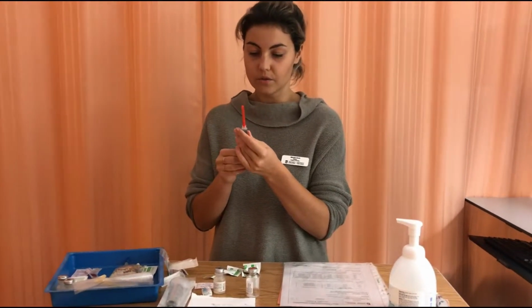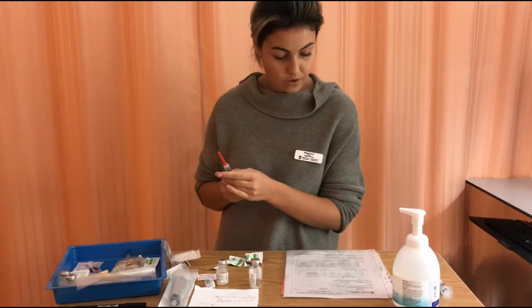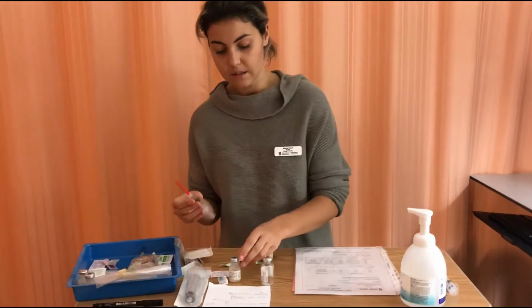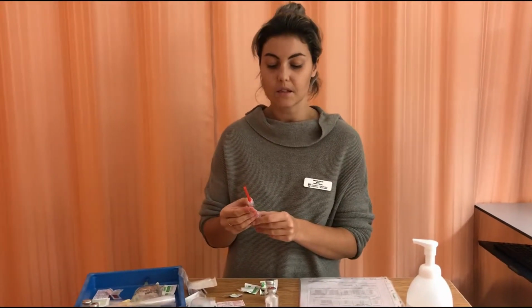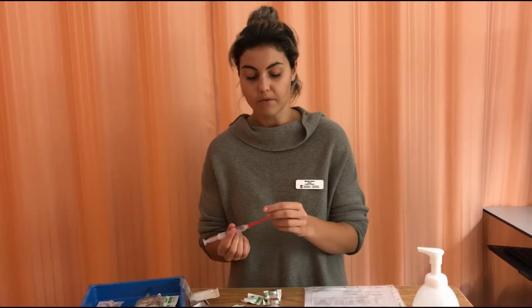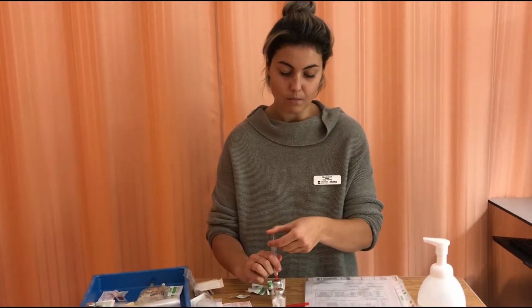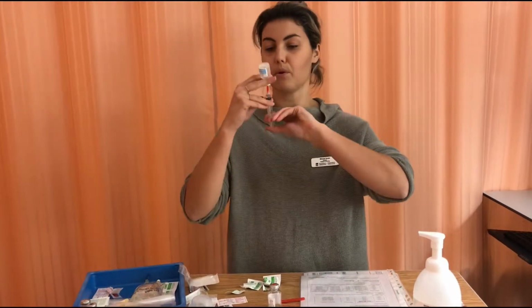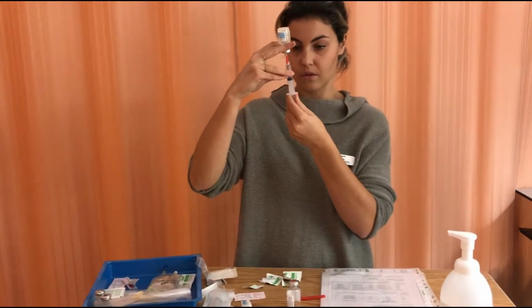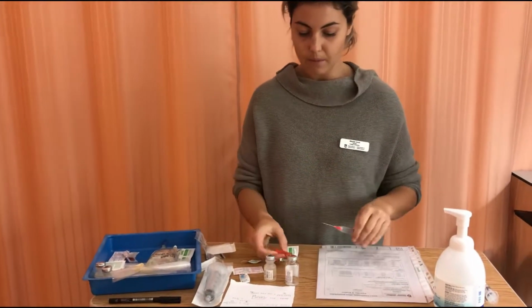And just fill my syringe with the air that I need to use to place the pressure, so 3.1. So because it is the diluent, I am just making my best estimate to go between the 3 milliliters and 3.1 milliliters. If this were a medication, that would not be an option just because it needs to be more exact, but for the diluent it is appropriate. So I'm just drawing up the 3.1. I'm just going to make sure that I don't have any bubbles in there.